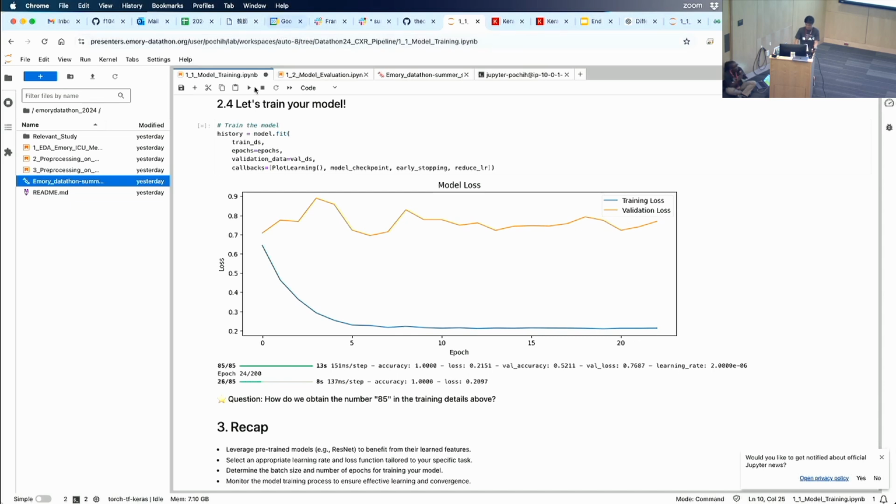And to do that, you have to decide how many times your model is going to see the data. That's the number of epochs. But you cannot load all the possible data sets that exist. You cannot make all the cookies at the same time. So you have to load the data in batches. Several batches make one epoch.